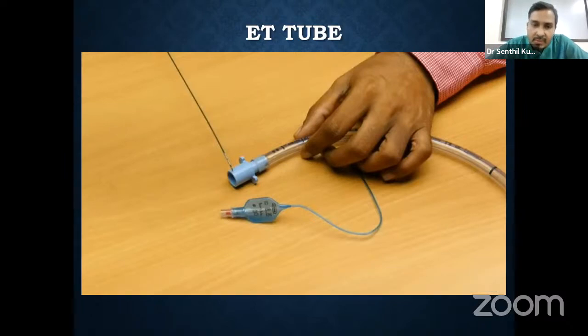So what is the importance of this cuff resting diameter? Whenever the cuff resting diameter is more, like 25 or 30, it tells us something. The cuff resting diameter is nothing but the diameter after inflation in a patient, once it has equilibrated with the temperature of the patient, it is going to occupy a certain diameter. With this diameter we will know how much pressure it is going to exert along the walls of the trachea.